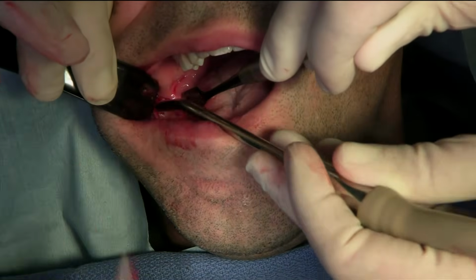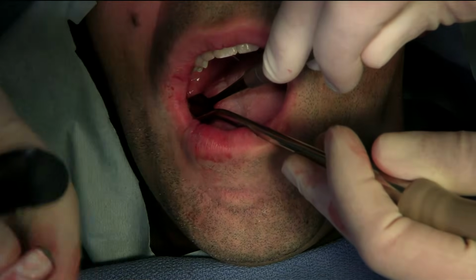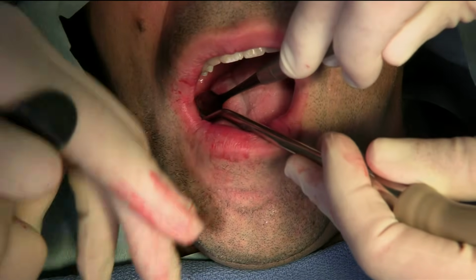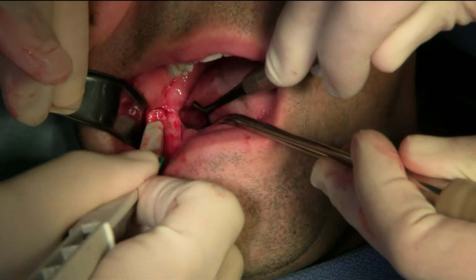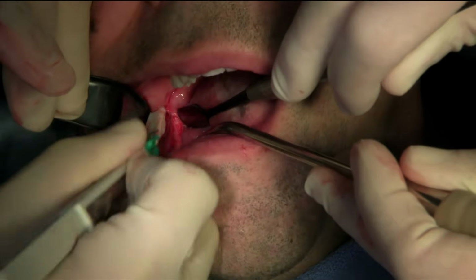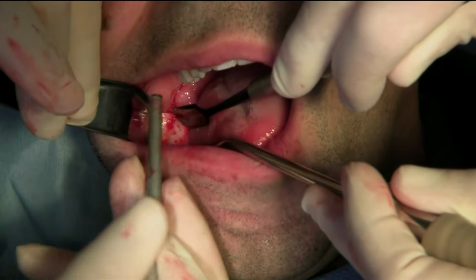We have the metal one. Why is this open? Can I have the metal scraper? Just opening a little bit. Just a little bit of pressure. You can take that bone out.